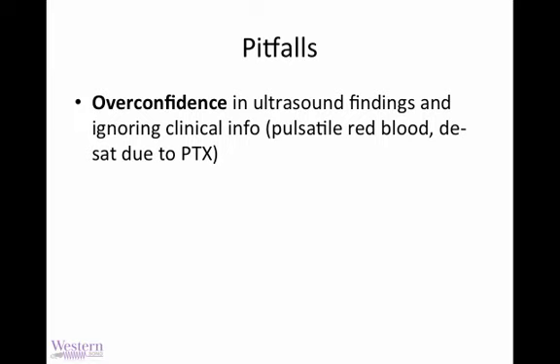So please, as best as you can, try to be very humble in your findings and recognize this is a new skill for you, taking in multiple data points while performing a complex set of interactions with needles and Seldinger technique and sedated or critically ill patients. So just a little bit of humility up front will go a long way. We often see a spike in complications for early users of ultrasound guided access because they start ignoring their basic senses regarding where their needle might be or where they are in the neck.